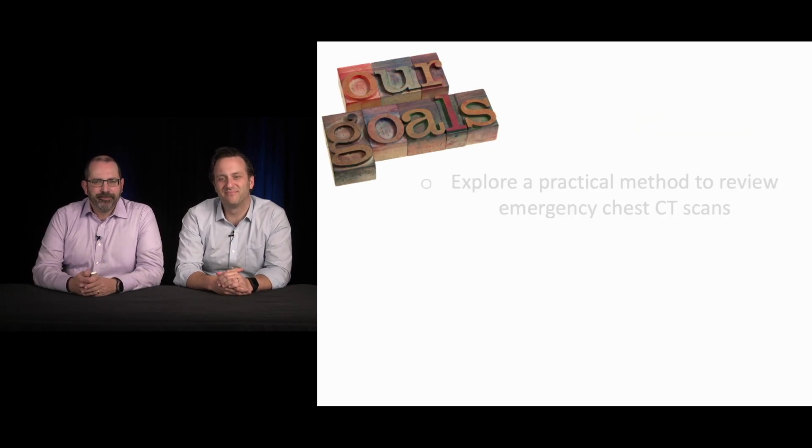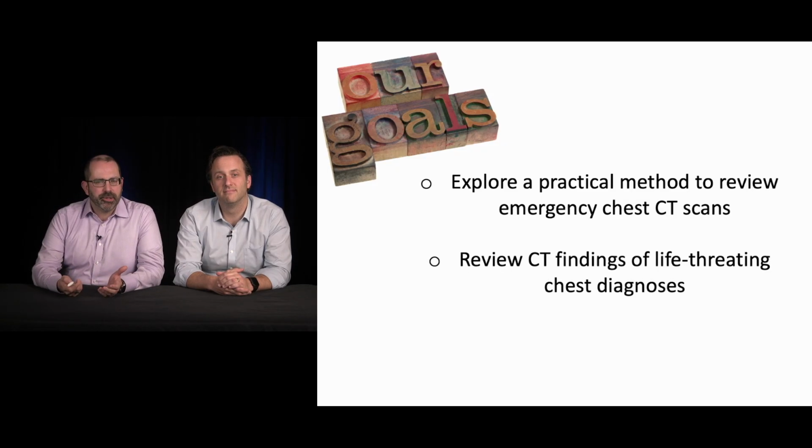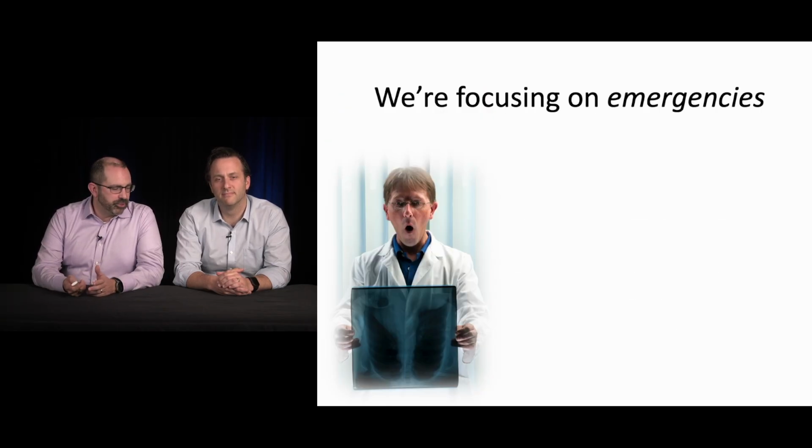So our goals today, we're going to talk about a practical method for reviewing emergency CT scans of the chest. We're going to talk about some of the common findings in life-threatening CT diagnoses and talk about some of the common pitfalls. We're focusing on emergencies here, all right?